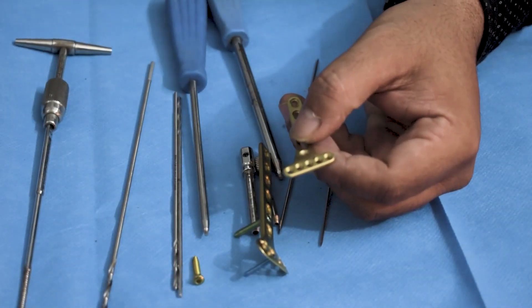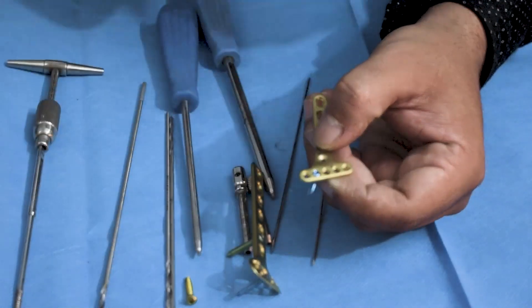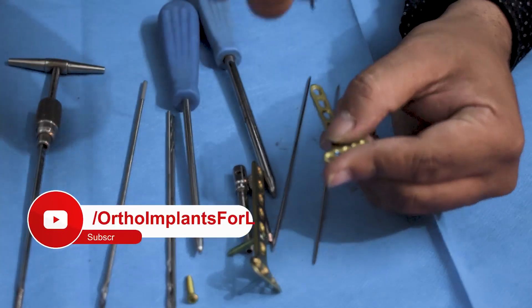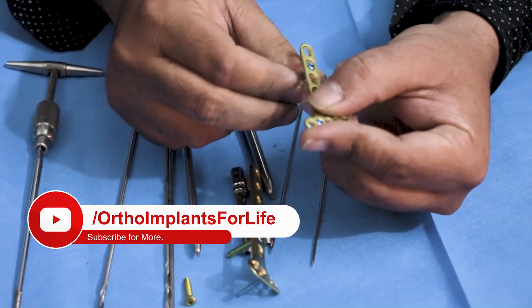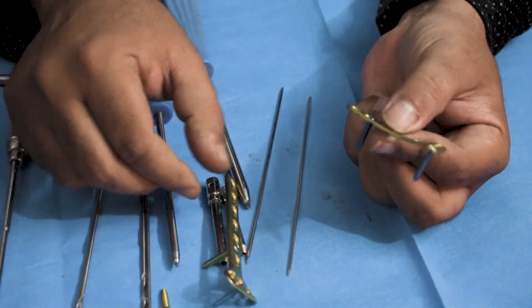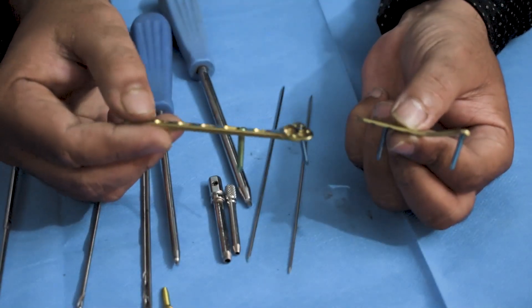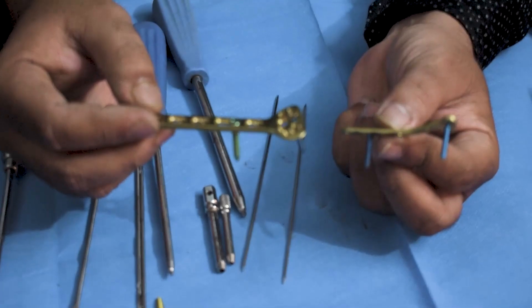For the extra-articular plate, which is a 2.7mm system, you have to use 2.7mm screws. And that will be all for today.